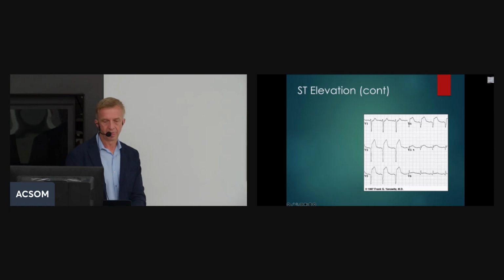These leads overlie the left ventricle. So this is an acute anterior wall myocardial infarction, usually caused by the occlusion or severe stenosis of the left anterior descending artery.